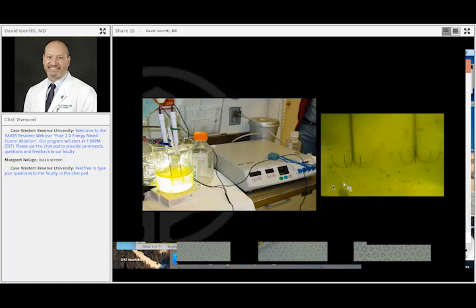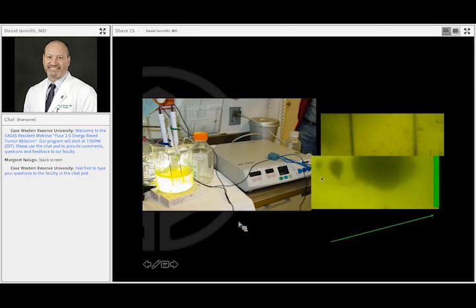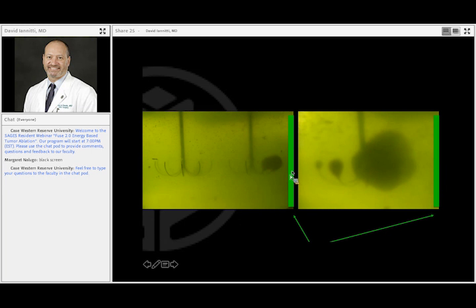One would think that the energy distribution across that array is even, but that's actually not true, because electricity does two things. It always seeks ground and it always takes the path of least resistance. So it doesn't make sense from a physics point of view that the current would be evenly distributed. When you start applying current, and say this green bar is where the ground is in the beaker, you focus the current along the tine with the least resistance or impedance, in this case next to the ground, and you start getting thermocoagulation around that tine. As the impedance of that tine increases, the current will jump, and then jump again. You can clearly see this would be an opportunity for incomplete ablation, particularly if a tine went into a low resistance structure like a bile duct or a blood vessel, which you may not see.